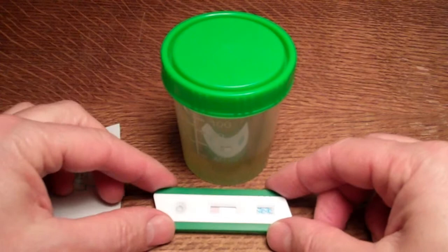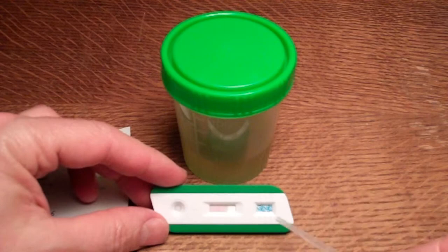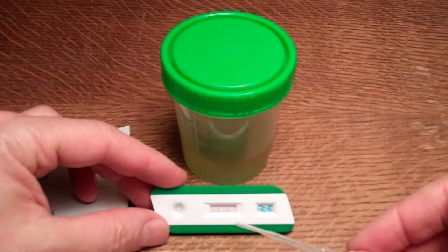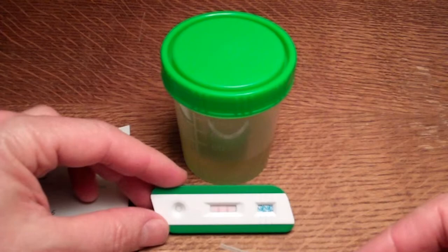Now on this cassette, you will see in the results window, which is the central portion of the test, the pink dye flowing from the sample well end of the cassette towards the far end where the THC coding for cannabis — tetrahydrocannabinol — is listed in the window. What you'll see developing here is a control line which is nearest the end window, and the test line, indicated by a T, which forms nearest the sample well.